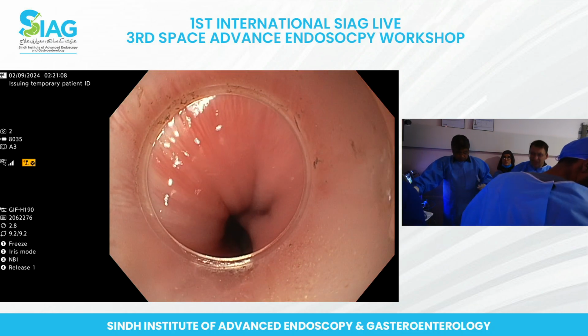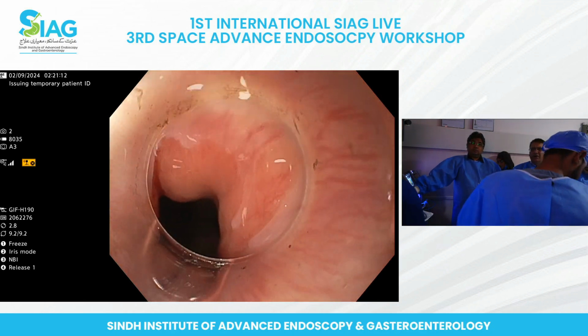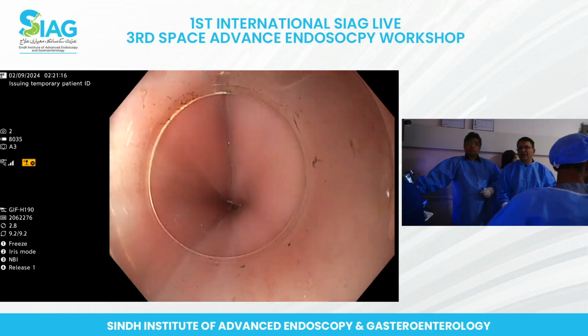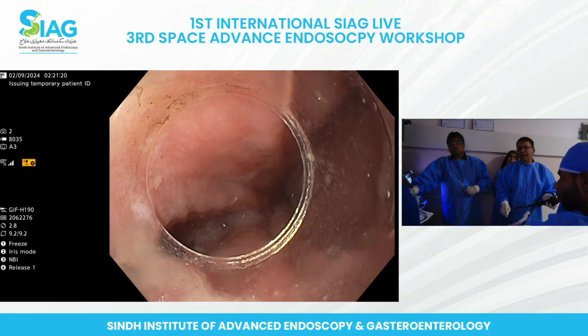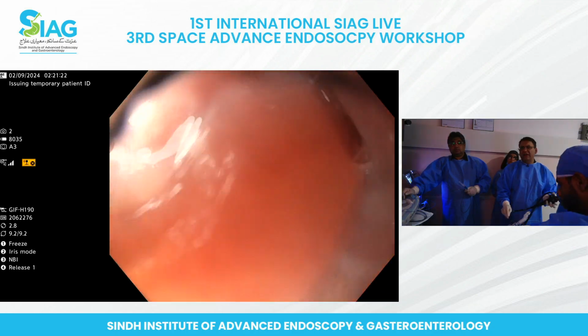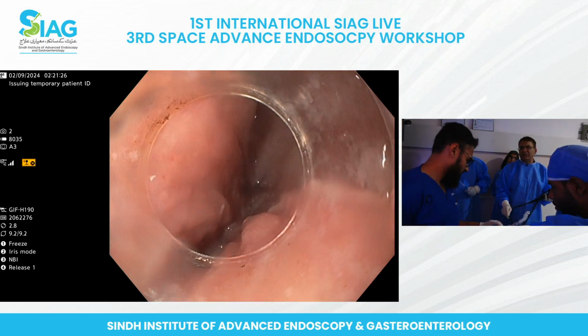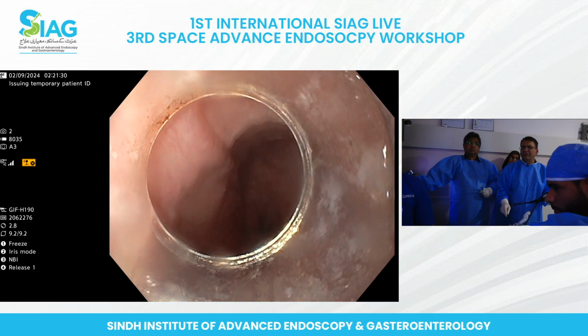that could cause a deeper injury to the mucosa and go into the deeper layer. So you don't want to be doing a patient which has an active esophagitis, basically, for multiple reasons. That's one of the reasons which I mentioned, and the other is risk of infection and everything.